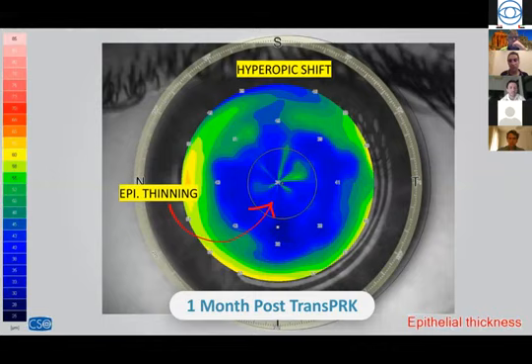So if you can compare to the epithelium, you can reassure yourself that this overcorrection is from the epithelium and it's not yet a true overcorrection. Some patients have a faster epithelial recovery. Some patients have less. Sometimes for me, it's time to decrease the topical steroids, because topical steroid will make the epithelium a bit obtunded, a bit lazy, and everything looks fine, no haze. I cut down on the steroids and the patient gets epithelial recovery much quicker.